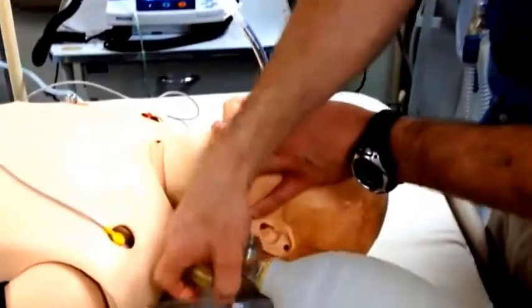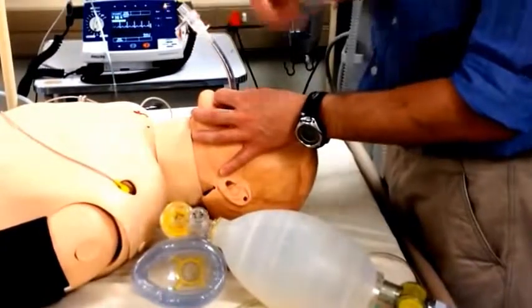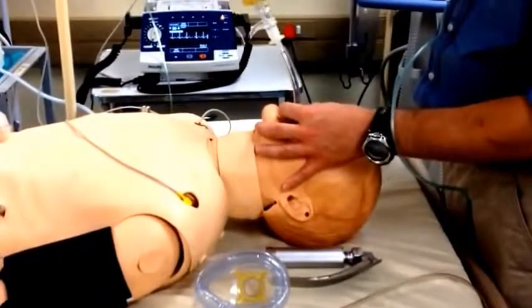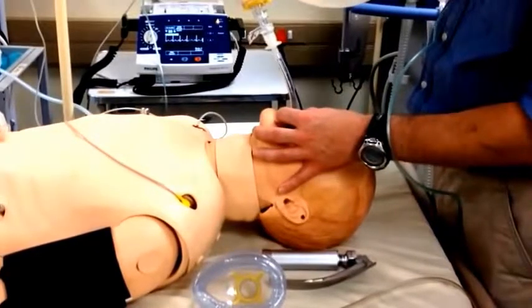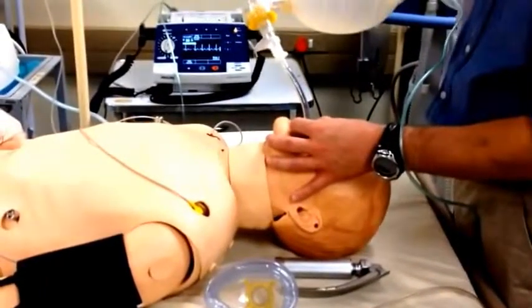You would now attach your secondary detection device, in this case a CO2 colorimetric detector, and then your ventilator device to the tube. And then you would confirm position of the tube. Classic 5-point auscultation can be performed by an assistant, or an assistant can take over control of the airway while you do the auscultation itself.